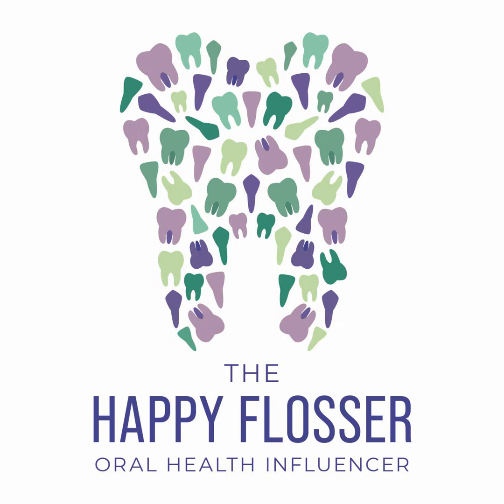And then the crown to root ratio is an indication of the stability for prosthesis and the susceptibility of disease for that particular tooth. So if you have a patient who has already lost some teeth due to periodontal disease or infection, and they're looking into some kind of prosthetic, it's really important to evaluate the crown to root ratio to determine the stability of the remaining dentition to accept and support a prosthetic.